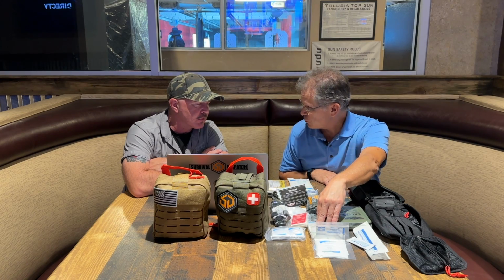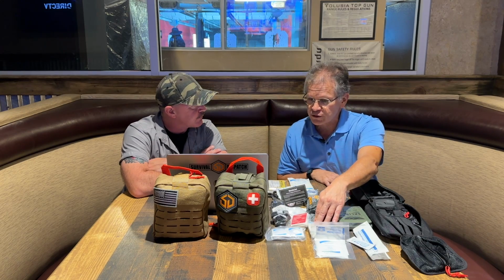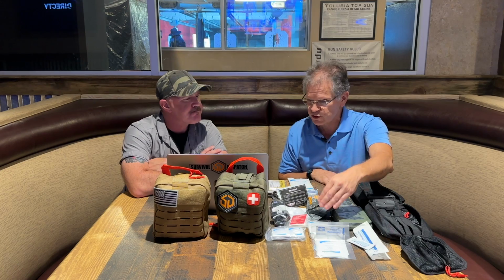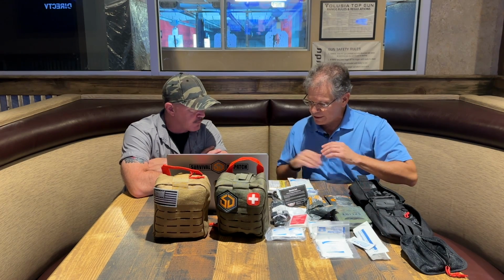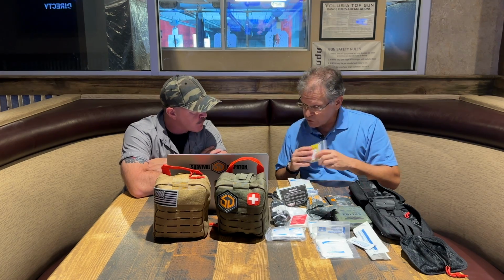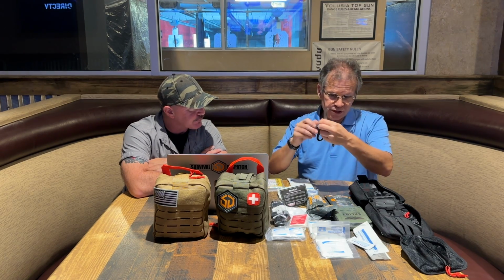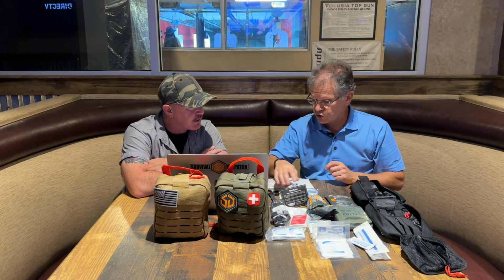Okay. There's also a triangular bandage, which you're familiar with, to make a sling out of. Yep. So if you have a small fracture or something, you can hike out with that in place. That's a bandana, and you can use it for multiple other things as well. There's alcohol swabs. There's also some 4x4s and smaller bandages, an emergency thermal blanket so that you don't go into shock. Yep. So those are all important things. Also bandage scissors, so that all of the bandages and things that it comes with, you can customize and cut to what you need to do.